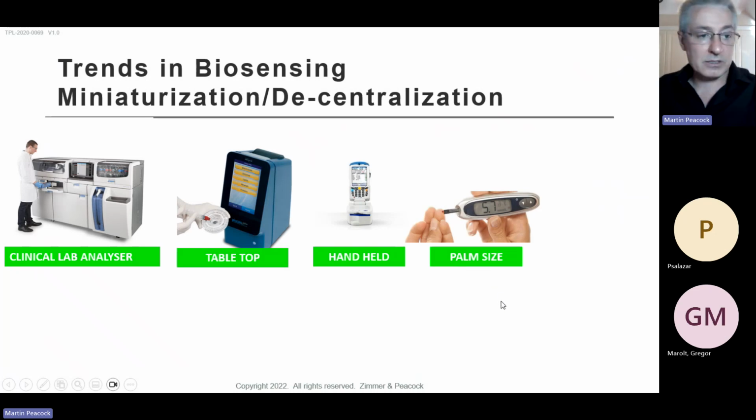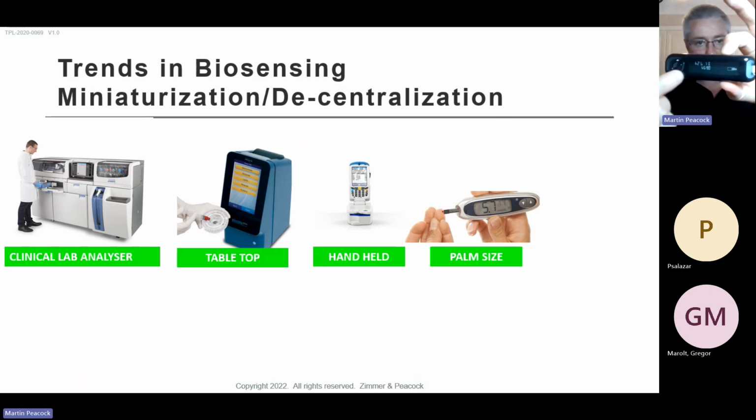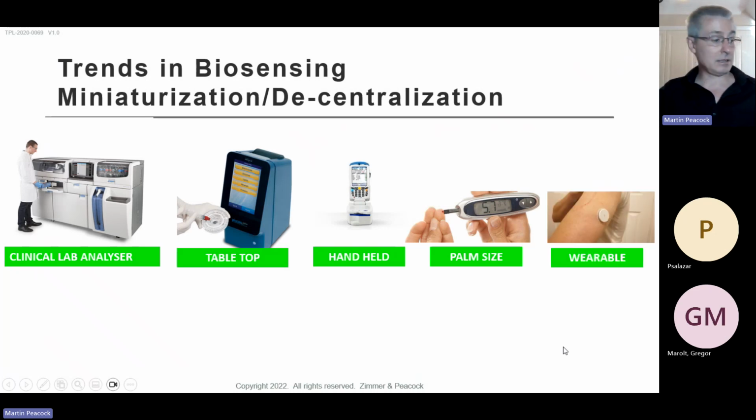And then it became palm size. When I say palm size, I've got a glucose meter in front of me here, so I'll hold it up to the camera. Now you're really shrinking down, and that's the power of electrochemistry as well. Anyone who's ever torn apart a glucose meter will understand that there's a coin battery in here, and about 25% of this is the battery at the back of it. Small, low-cost electronics works really well, or you can do electrochemistry on small, low-cost electronics. And actually the electronics have then shrunk down even more substantially.